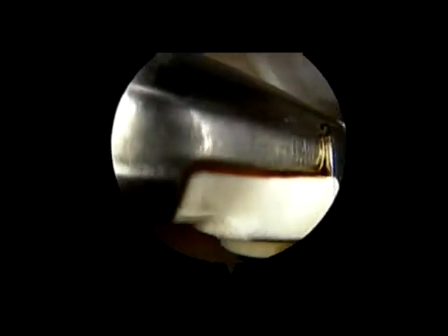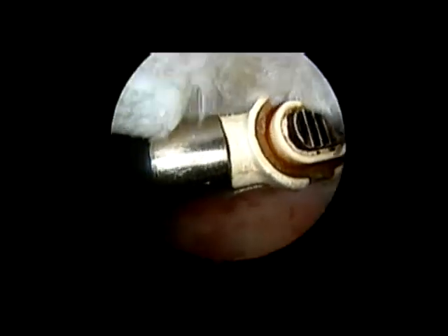Here you can see me using an arthroscope to repair a rotator cuff. The red is bleeding from where the rotator cuff has torn right off the bone. This big white flap here, that actually should be attached to the bone.